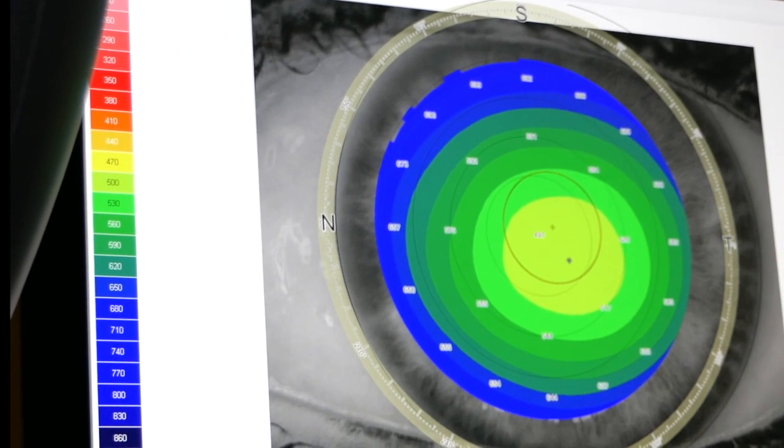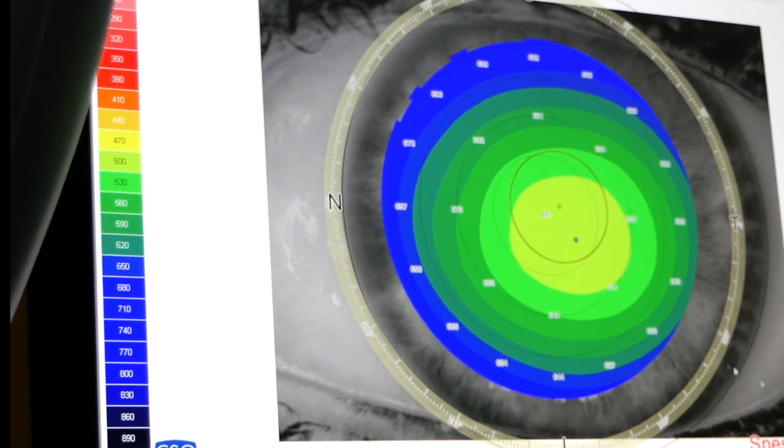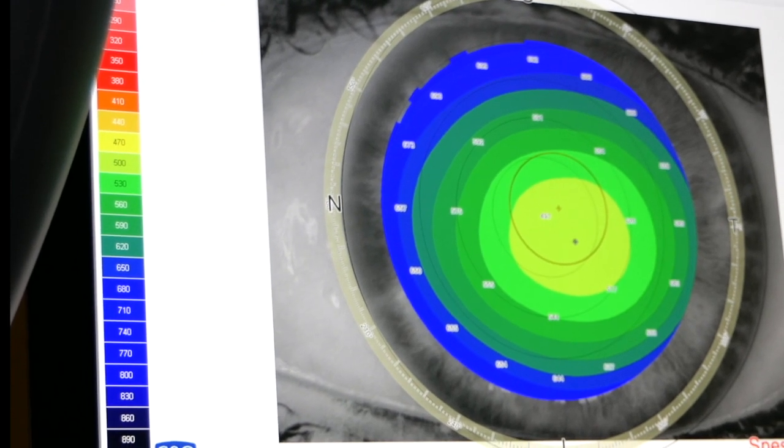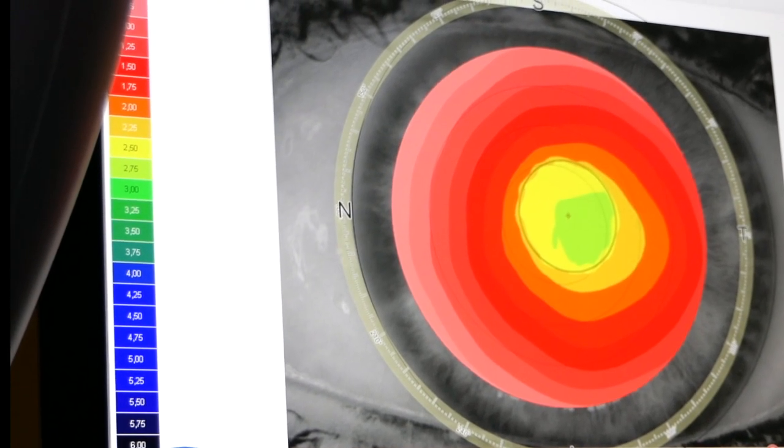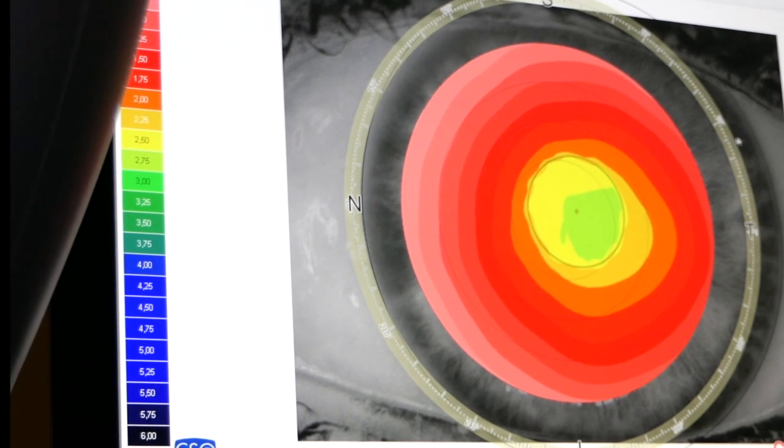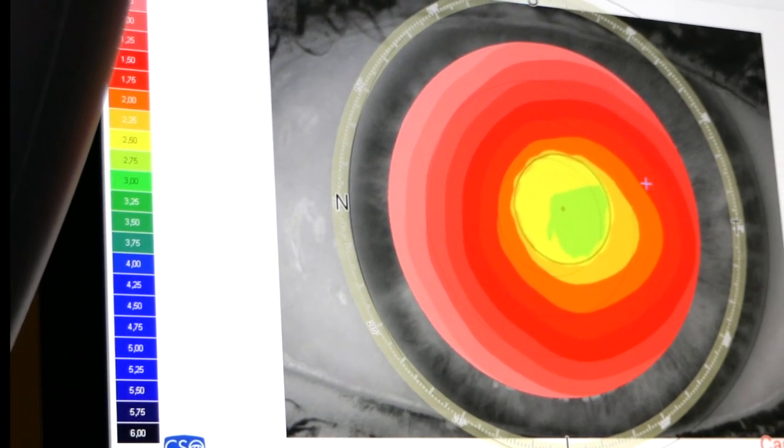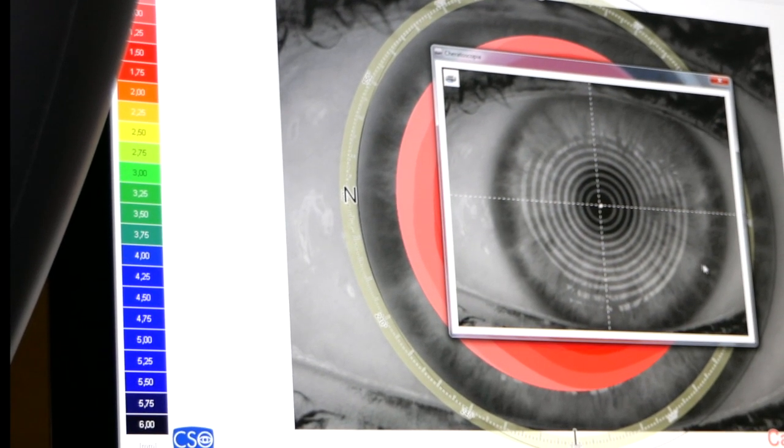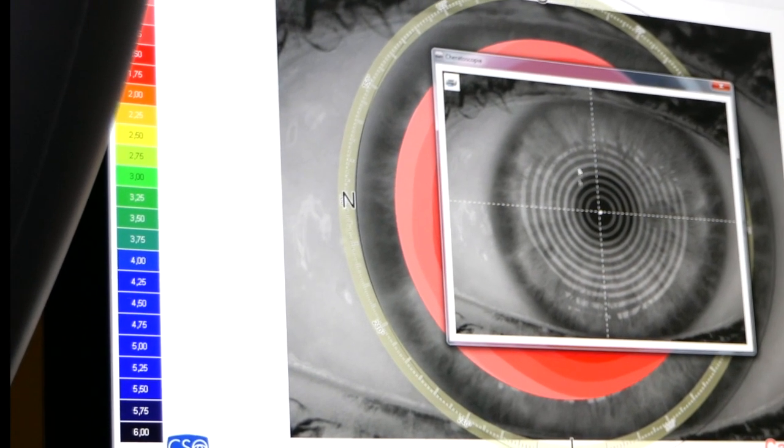This is very important because the corneal thickness is one of the parameters, together with the curvature and relative height of the cornea, to determine whether the cornea itself is healthy or sick. Thin corneas may hide a pathology such as keratoconus, while two thick corneas may hide a corneal endothelial disease.